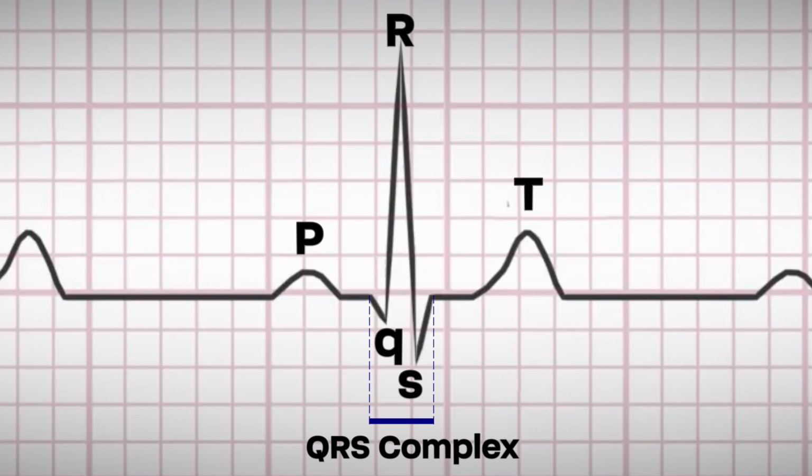Please reference the alphabet. There's also sometimes an extra deflection following the T wave known as a U wave, which is also connected to ventricular repolarization, but they're not particularly common, so we're going to completely omit those in our discussion until they become relevant.